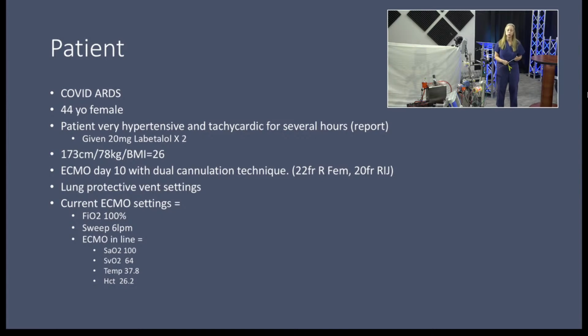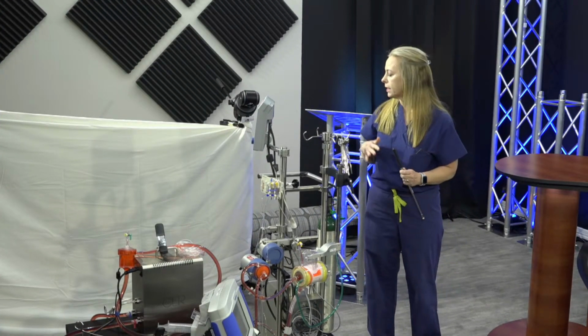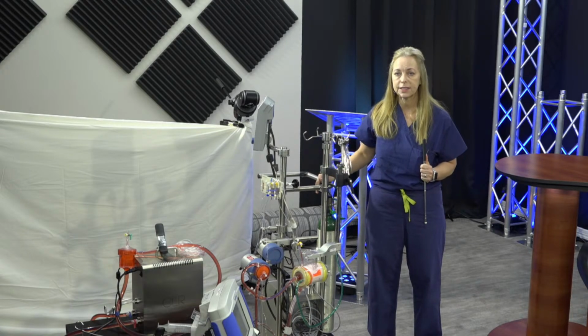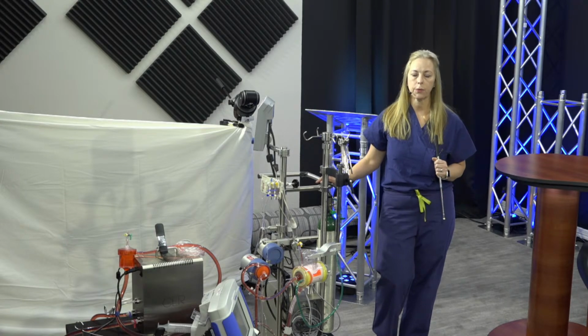And then if you're ever going to transport outside of your facility, you are going to want to make sure it's something that can get into an ambulance. Even when you ask for those big box ambulances, they're very small on the inside. This particular one can break away from the trolley. You just grab this handle here and you can pick it up, and it can be placed on the patient bed. And many other devices, I'm sure, have similar capacity, but some are made just to stay within the hospital.